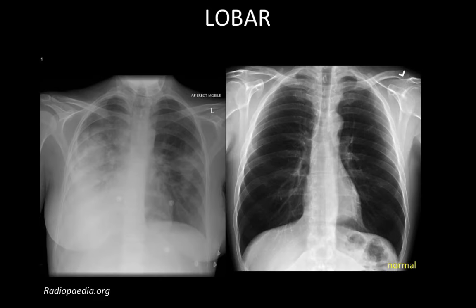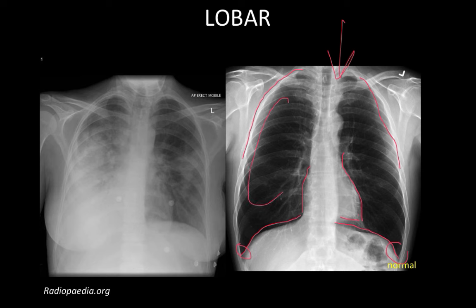Here are a couple of examples of pneumonia infiltrates. This is what a normal chest x-ray looks like. You have very clean pleural margins that are not thickened, obvious sharp costophrenic angles, and you can see the whole length of the diaphragm on the left side — very clearly visible behind the heart. The heart borders are really sharp and clear, and you don't see any extra shadows within the parenchyma itself. Of course, these are margins of the scapula, not to be confused with a shadow of an infiltrate.